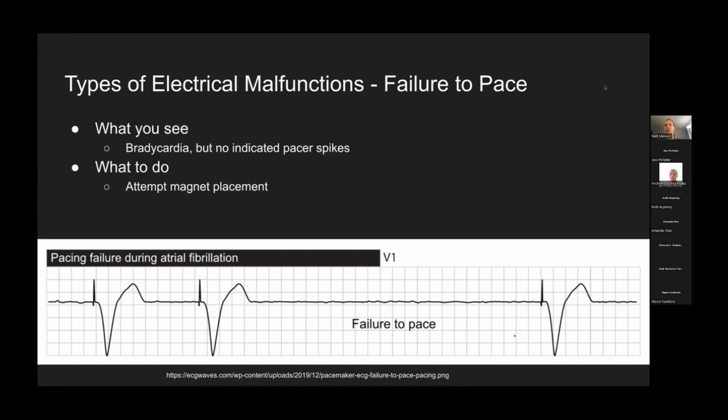In the mornings at shift change, where I work now as an ER doctor, we have a 5 minute educational talk on various topics. One day, one of our consulting ER docs, Dr. McCarran, did one on transcutaneous pacing, and he actually paced himself to demonstrate how safe the procedure was and how tolerable it could be. I'm not recommending anybody do that, but I saw a video of it and that was just wild to me.